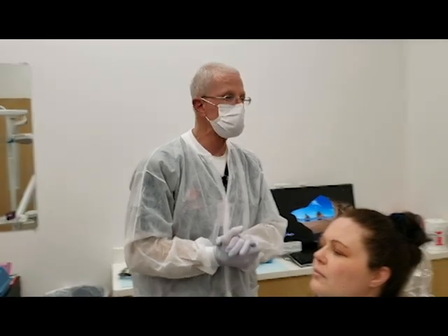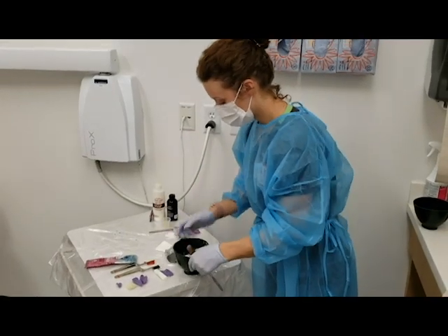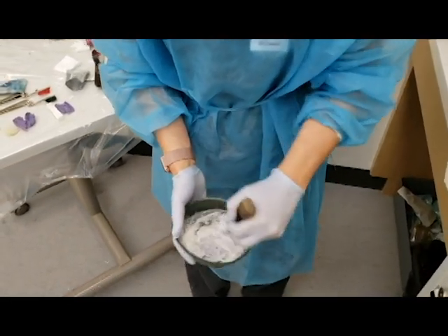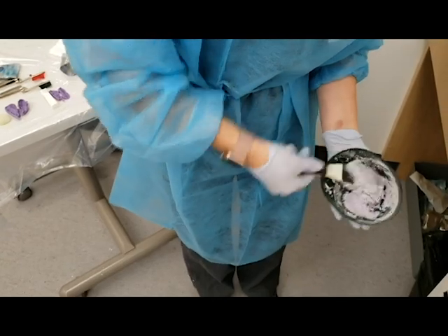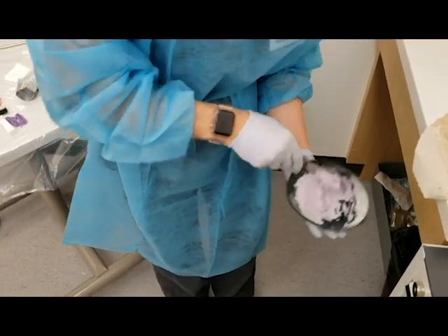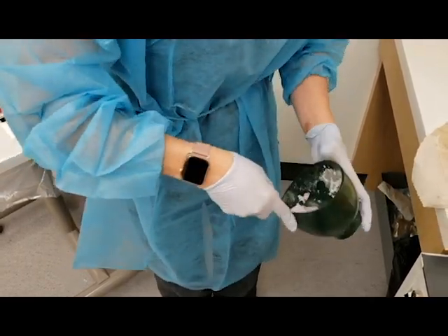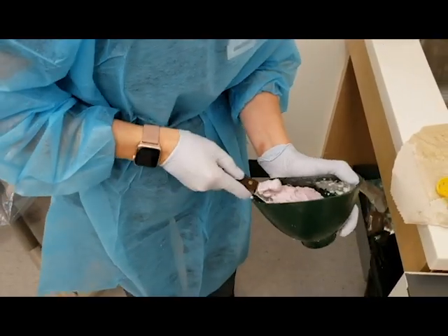Go ahead and mix the alginate. As I'm mixing, I like to incorporate all of my powder into the liquid. Once I see that I've got a pretty consistent mix, I like to mix it like cake batter — back forth, back forth — make sure you've got a good grip of the bowl. And then scoop it all into a little pile.